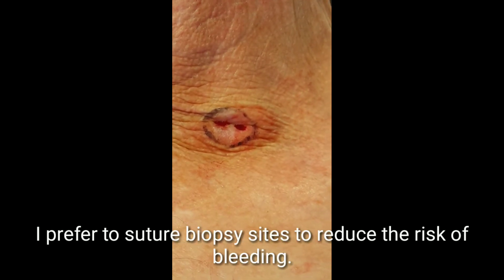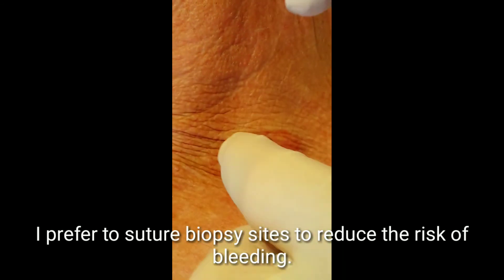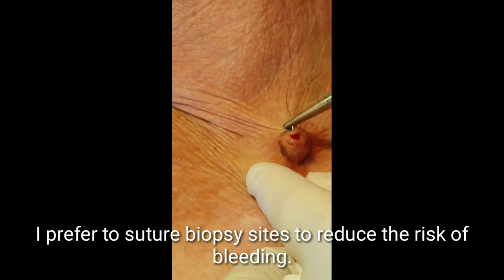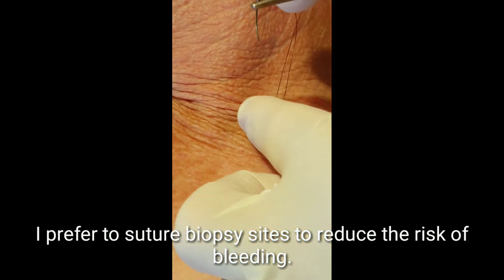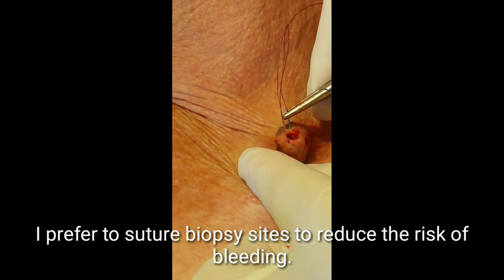Punch biopsy sites may or may not need to be sutured. On the face, particularly the nose, suturing is usually required due to profuse bleeding. However, an area such as this which is not bleeding does not necessarily need to be sutured.